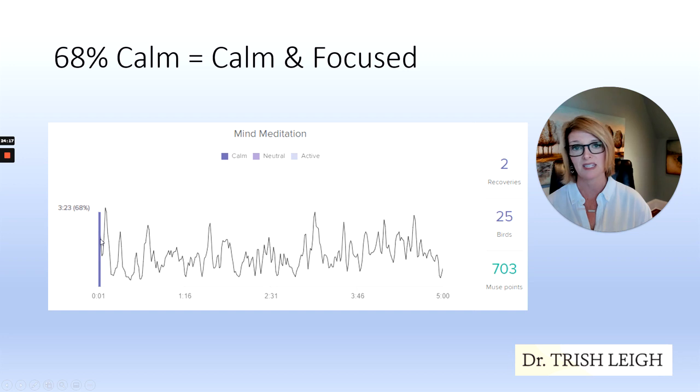Now you can see the brain starts in the calm zone. Yes, it spikes up and we have recoveries. There's 2 recoveries from the active zone, probably this one and this one, from the active zone down into the calm zone. So it's up and down, nice push-ups for the brain. Overall, much calmer, much lower in the calm focus zone. Overall, longer periods down in the calm focus zone, less spikes up into the active zone, faster recoveries down, and just basically in the calm zone.